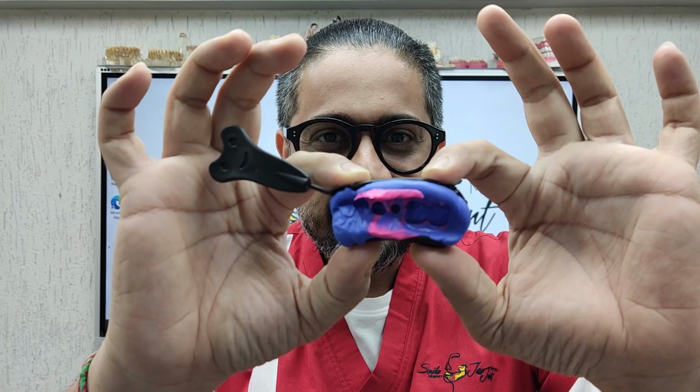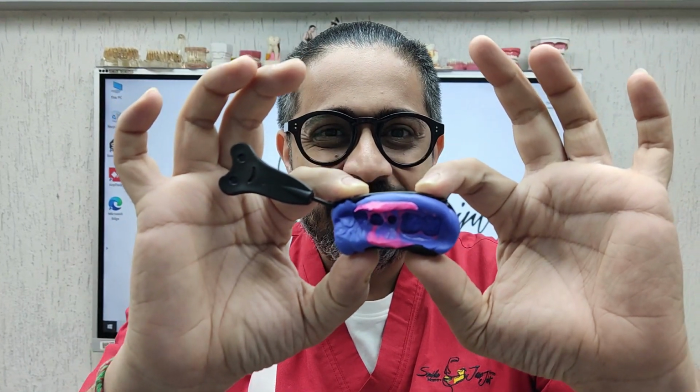Remember, when it comes to implant occlusion, the funda for a single posterior tooth is no contact in light bite, light contact in heavy bite. No contact in light bite, light contact in heavy bite. And you check this with a 20 micron or thinner articulating paper. And when you record your impressions in a functional position like this, the possibility of interferences significantly decreases and the possibility of prosthetic failure, that is post-loading failure of implants, will also decrease.